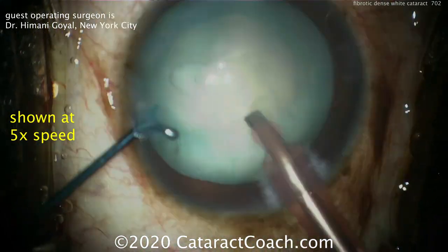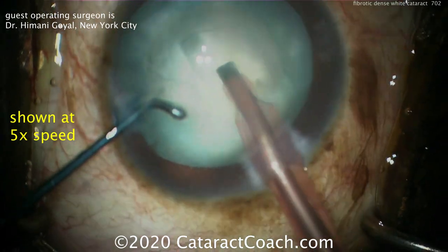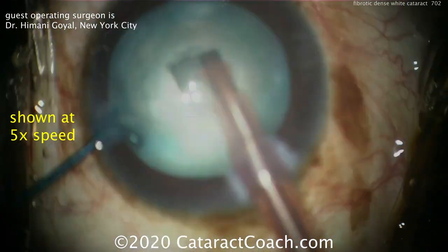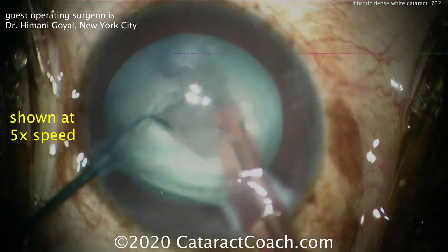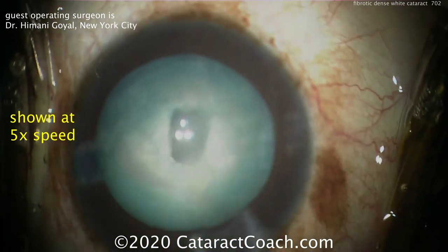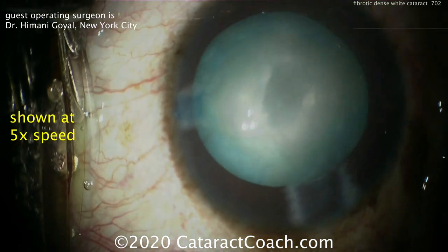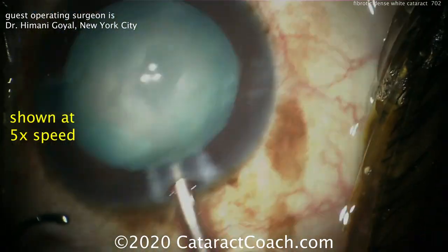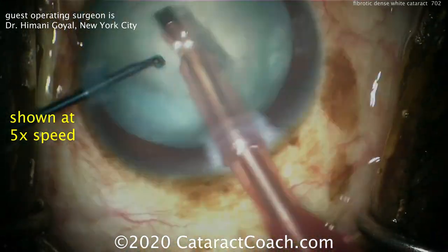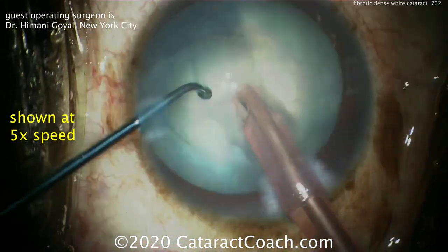Going in with the phacoprobe, the goal is to remove as much of the cataract as possible. The technique here is to do a groove down the middle, which is very effective — debulking that central endonucleus, which is the densest part. A little bit of separation to make sure we have two good heminuclear halves, then a little more viscoelastic as a protective agent. Then rotating and continuing that groove in the other direction, then splitting it apart.